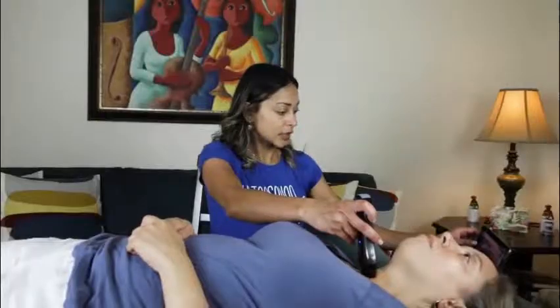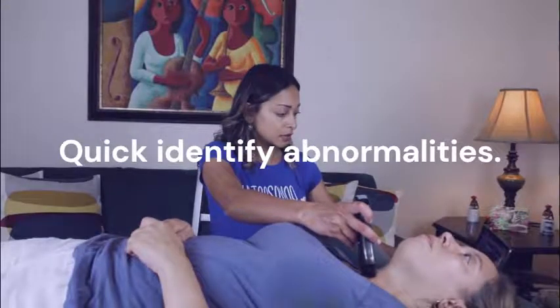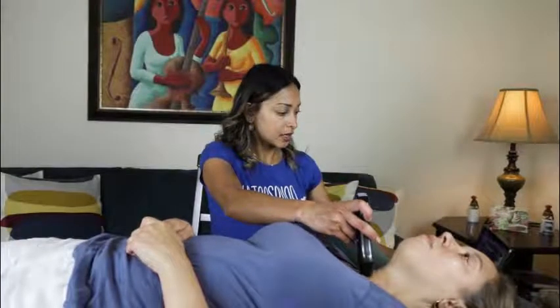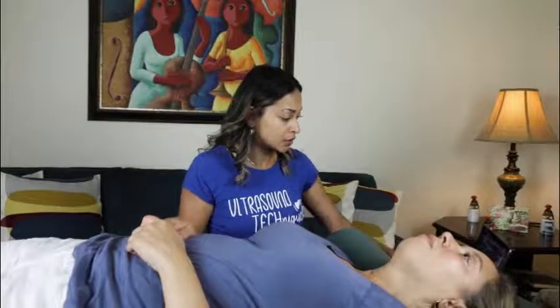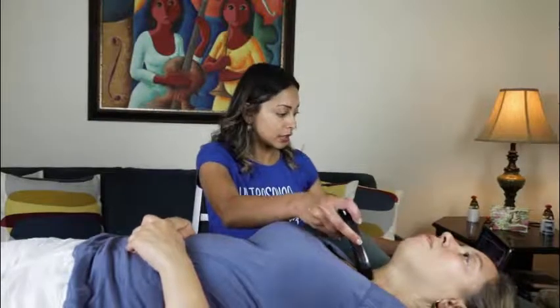This patient has a known thyroid nodule, and it picks up really nicely right there. I can see the borders. If I wanted to measure, I can measure. I'm actually just going to zoom out a little bit so that it's a little clearer.